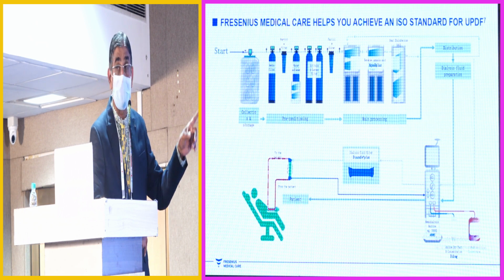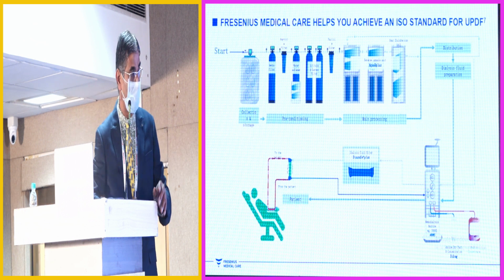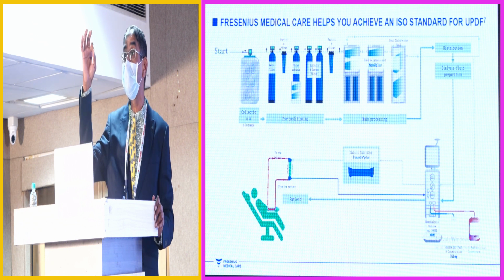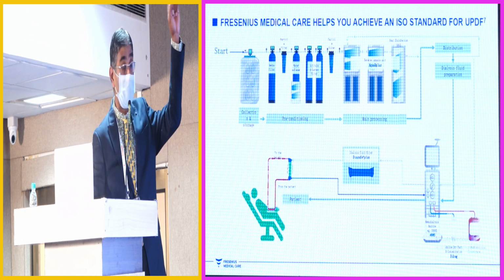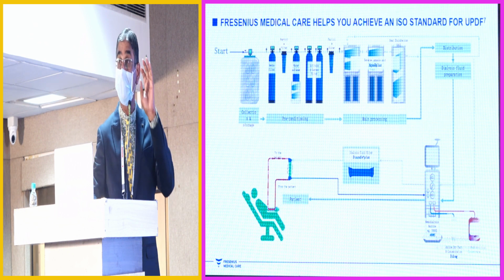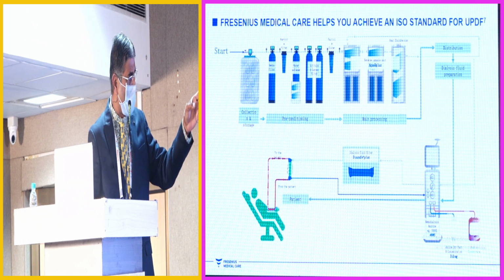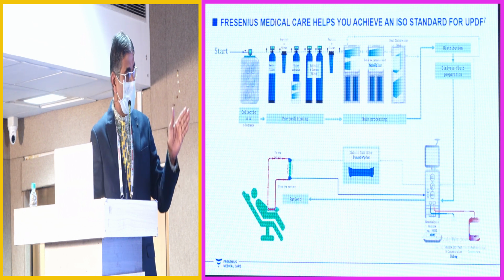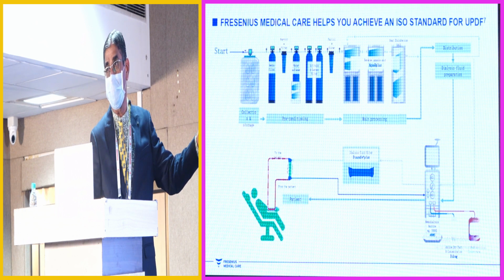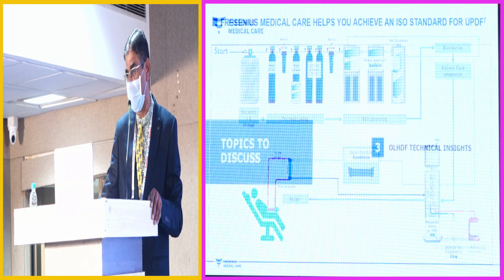Once that is there, you have a good dialysis machine, which is an online HDF machine, having 2 endotoxin retention capacity filters at 0.2 microns. In an RO system which is not online, you also have, after the UV lamp, an endotoxin retention capacity filter of 0.2 microns. So after the dialysate is manufactured by the machine, it has to pass through the endotoxin retention filters, and what comes out is an ultra-pure dialysis fluid.